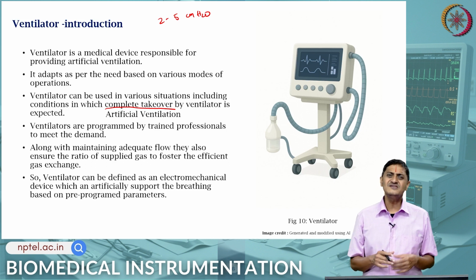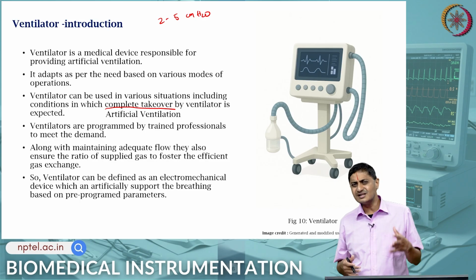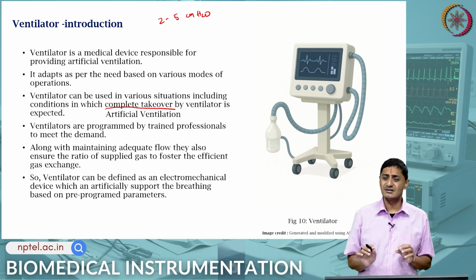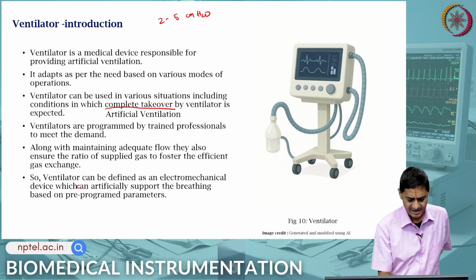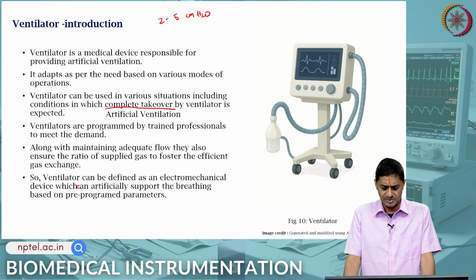So, essentially the ventilator is an electromechanical device. Well, it is electrically controlled, mechanically operated or mechanical output, mechanical actuation, but electrically controlled device that can artificially support breathing based on specific requirements, maybe pre-programmed parameters.